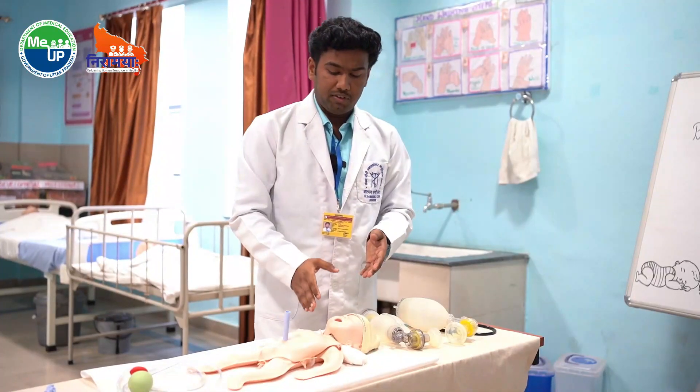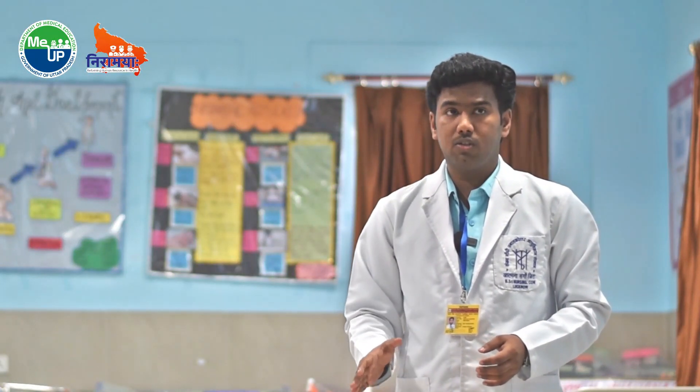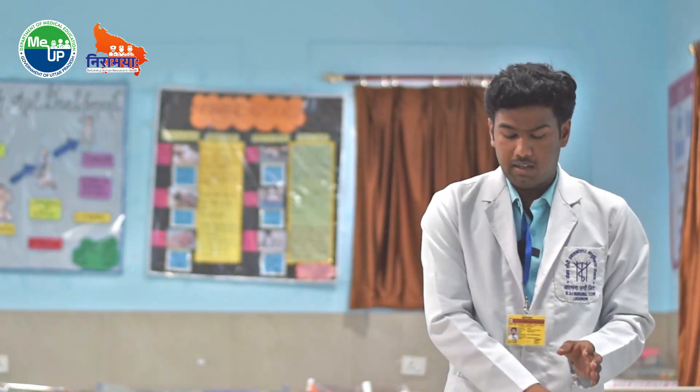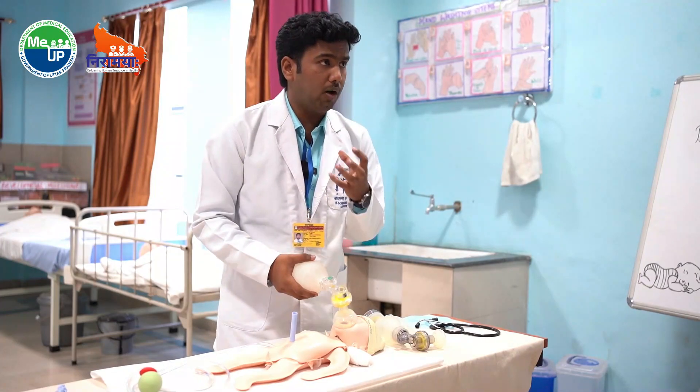Whether the PPV given is correct or not is checked by observing if chest rise is seen. If chest rise is seen, it indicates a good ventilation technique. If chest rise is not seen, it indicates there is leakage in the mask, a positioning problem, or a loose connection between the mouth and the mask.